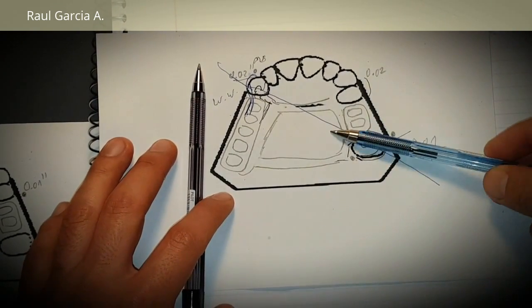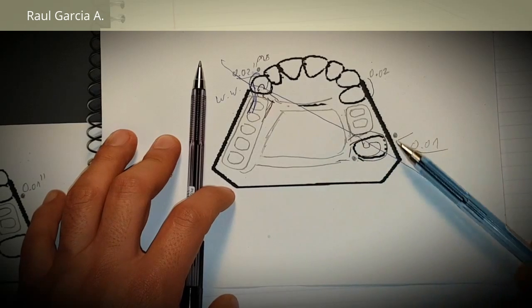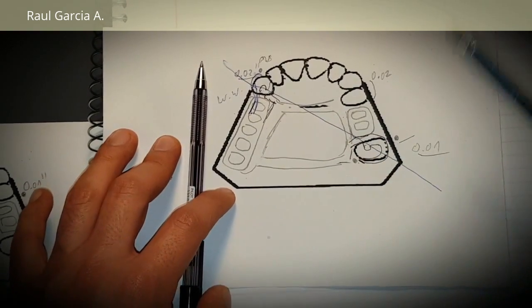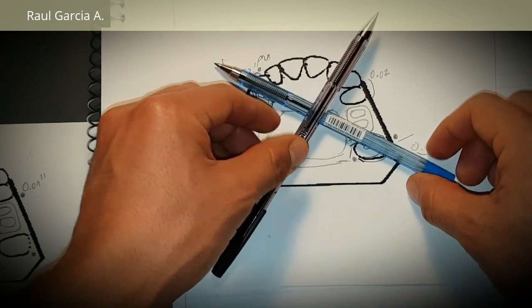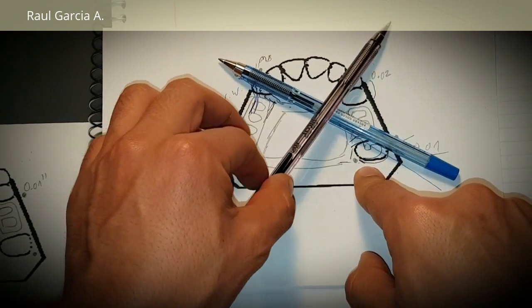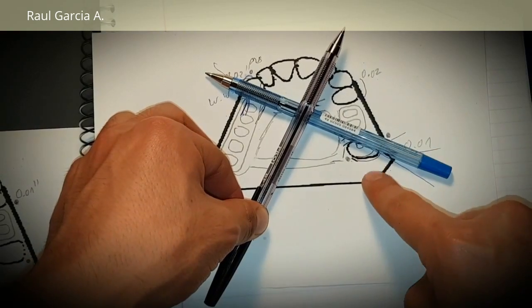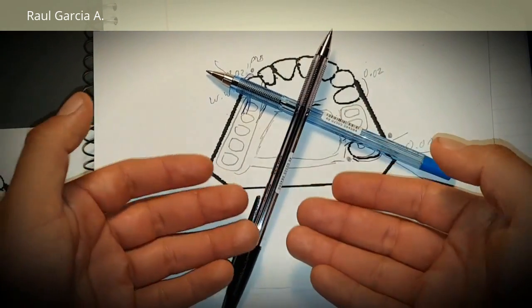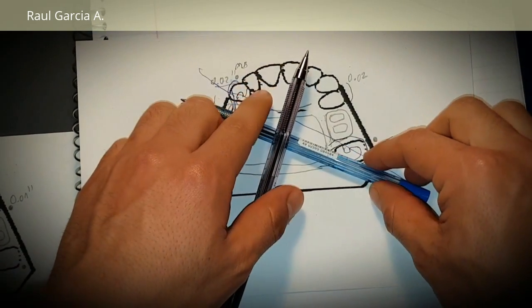So everything ahead of the fulcrum line, wrought wire, or all the options I told you. Everything that is on the same side can be cast. That's why we're putting a cast back action clasp. So how does the mechanic work? Why did you decide this? Because you don't want, when the patient bites here and the RPD is going to go to the palate with the pressure, you want this retentive arm to disengage and go down. It must not go up because you have the height of contour. It would lock and it would pull the tooth, if it were ahead of the fulcrum line.